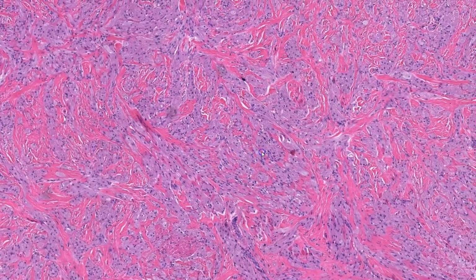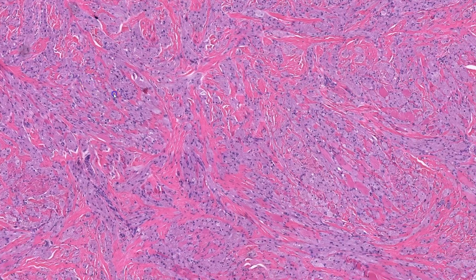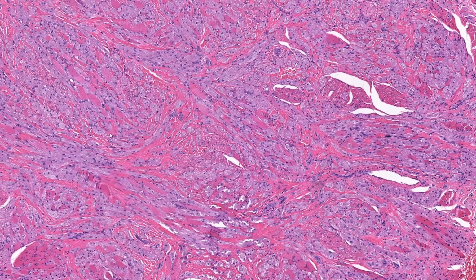Returning to our case, I can see that my initial impression of nests of pinkish cells and intervening collagen stroma was correct. I'll also add that these cells have abundant granular cytoplasm and small round nuclei, and that I can't really appreciate the borders between the cells. Moving to the area I was interested in on low power, I can see that the structures I saw were actually bundles of skeletal muscle. Not only that, but the cells are infiltrating between the skeletal muscle bundles and also around nerves.